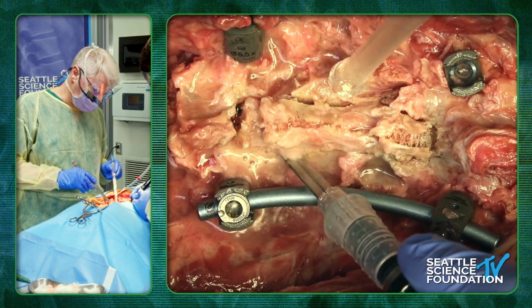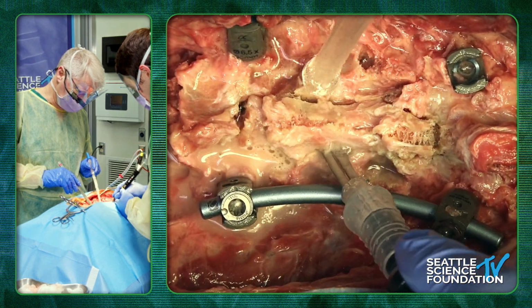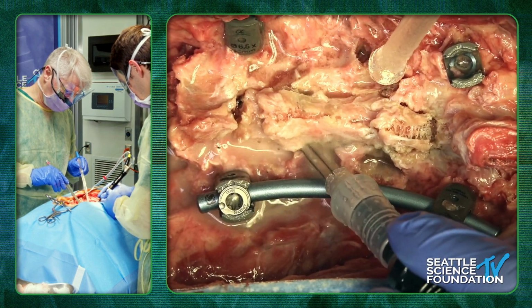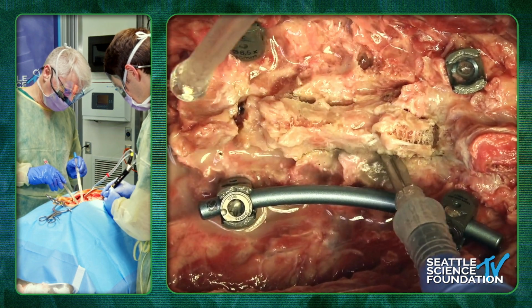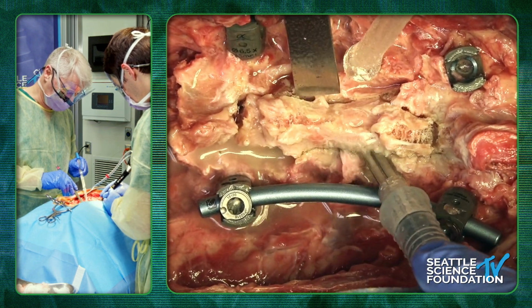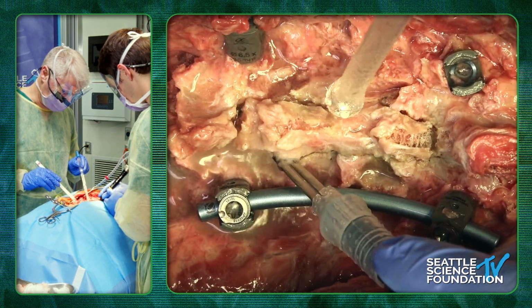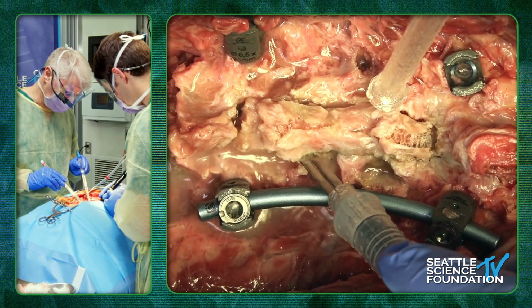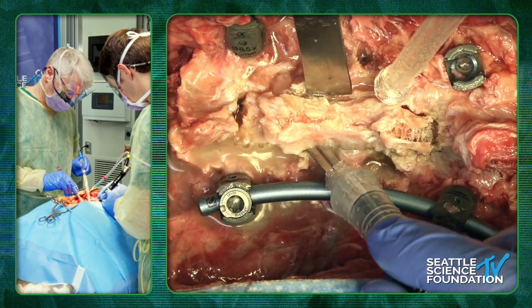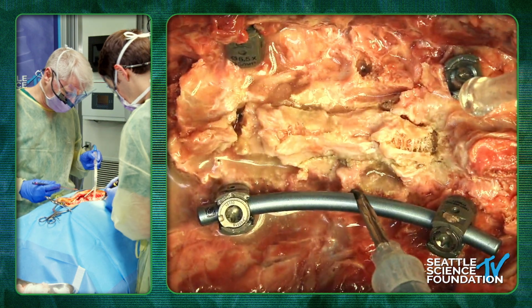I'm going to cut just to release it out. This will be our first part of our decompression for our osteotomy. I've tried it a couple times. I still use a Midas and a Kerrison. At the top, you need to do just a little bit more at the top here.